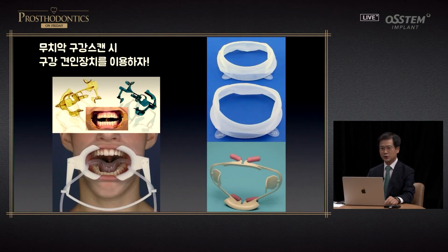It's not easy to get it on the first time. So you have to use this type of device to unfold the area for ease of the scan.